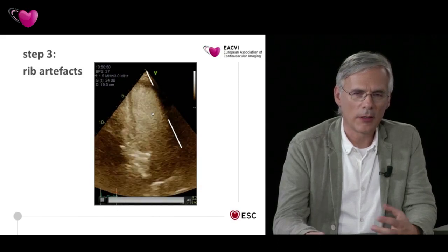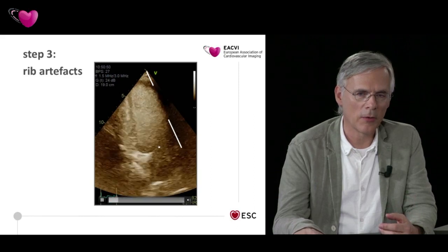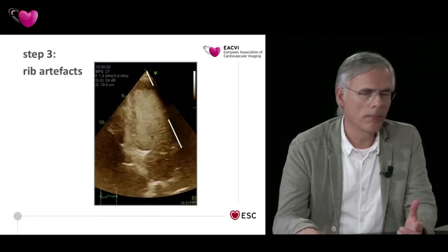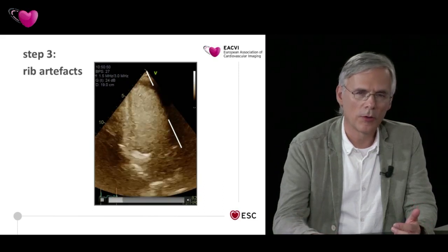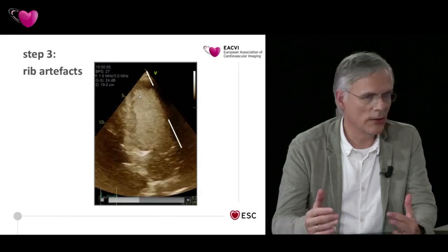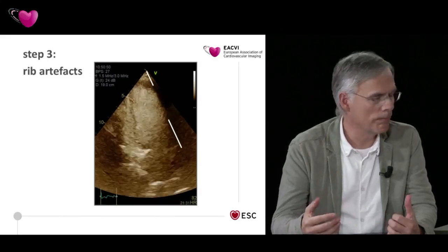If we look carefully at these images, here is some kind of attenuation, and this means we have some kind of overdosing. And on the other hand, here is a little bit of swirling with high signal intensity, so we have a little bit too high transmit power.